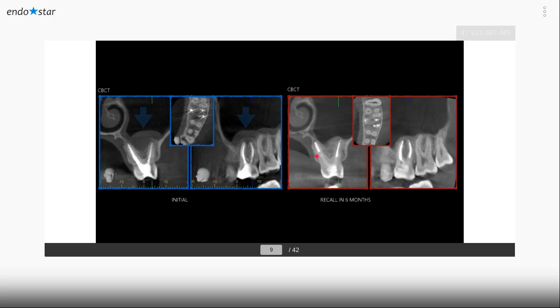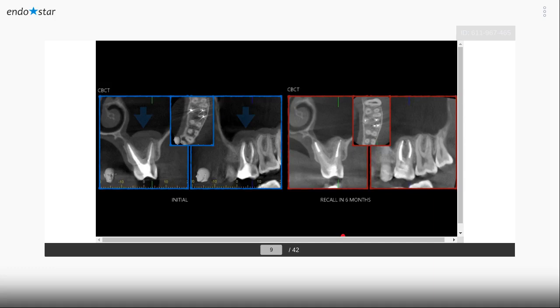We enlarged and removed the main debris, or the main part of the biofilm that was in the canal. So now we have cleaned and shaped our tooth properly, and we can achieve a good result. So what instrument to use for treatment?